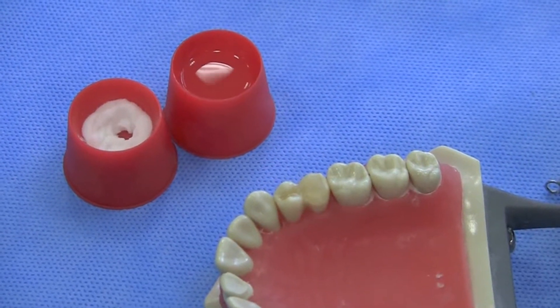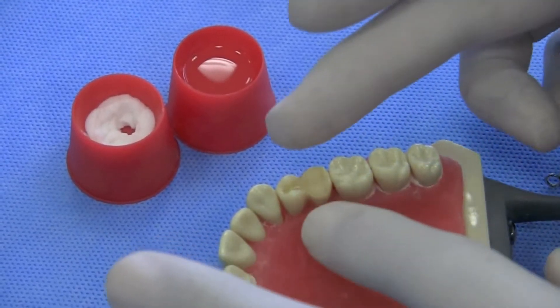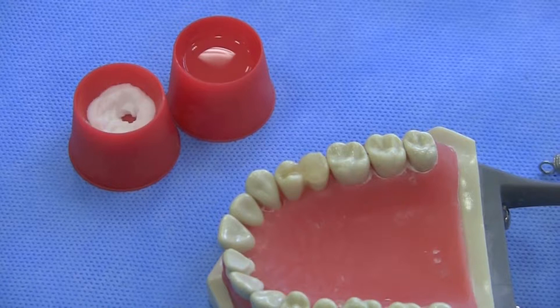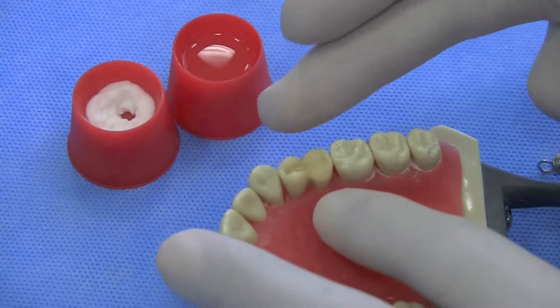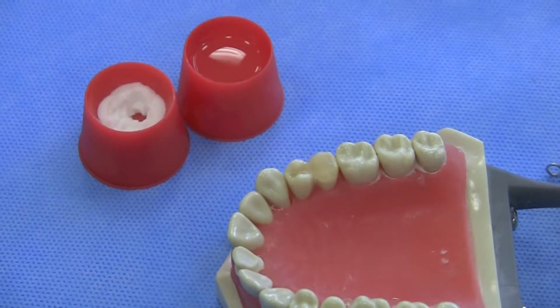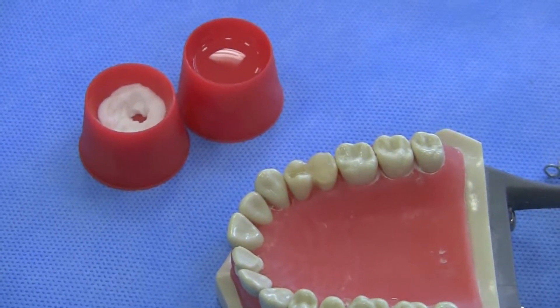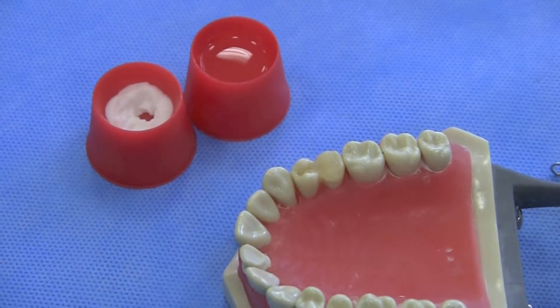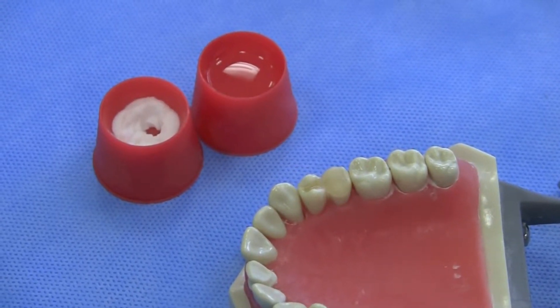This is just a short-term limitation. When we go to remove the product, the Gutta Percha will protect the tissues from any toxic elements. The tissue will actually be very healthy — retracted and typically not bleeding. This really facilitates delivery of the restorations. Note that this product does tend to leak a little bit, so there may be some sensitivity with some patients, though typically it's not a problem. Also instruct them not to chew on anything too sticky or gummy, as it will tend to pull these out. I'm comfortable with this temporary technique for up to two weeks. Any more than two weeks, we need to think about a longer-term provisional technique. It's not very sophisticated, but it's very, very practical.